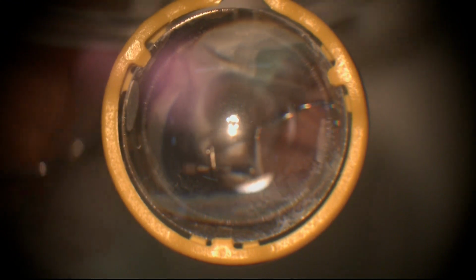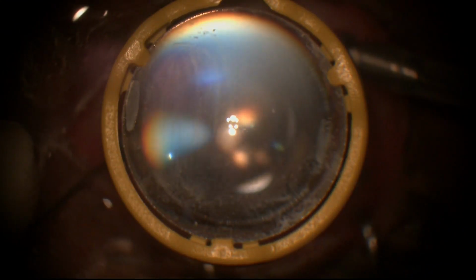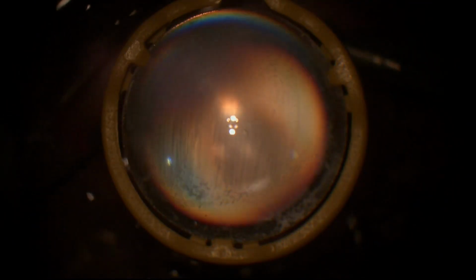So what I was telling you, that you need to invest 10 years in practice to know when not to intervene. So when you're starting your career, see, so much fluid has dripped down. We have dried that cavity, but there is no. And this also has some viscous with it.